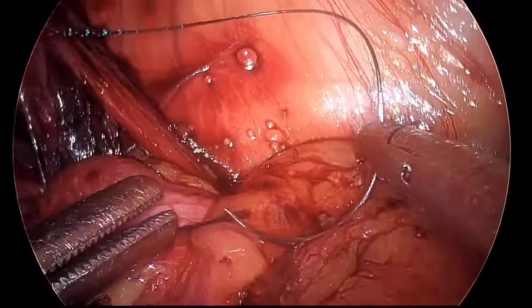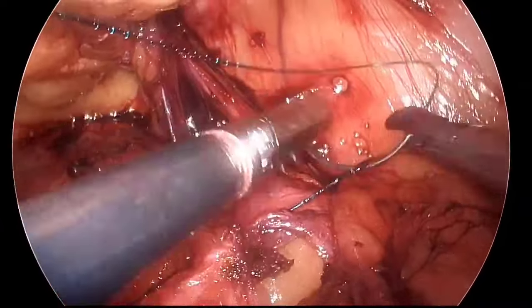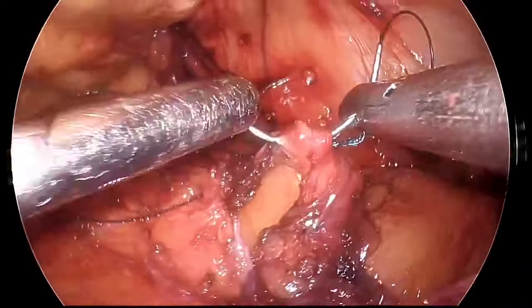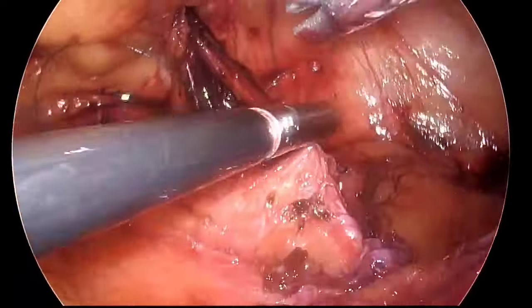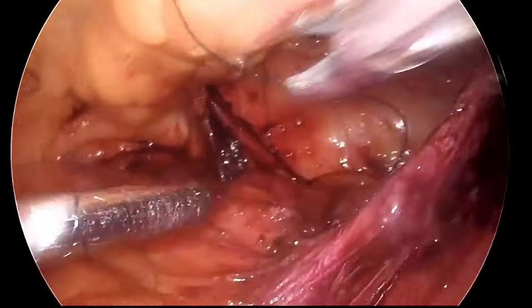As this is an eTEP approach, there is enough space, even though there is a large hole in the peritoneum, the space is not getting obliterated, as you can see. That is the advantage of the eTEP approach for this kind of large inguinoscrotal hernia.